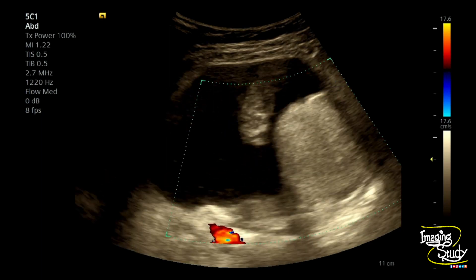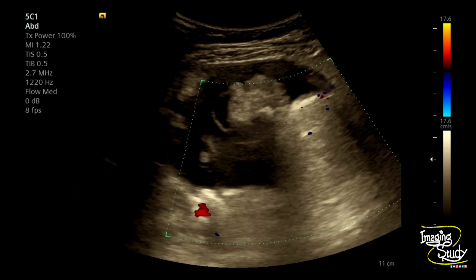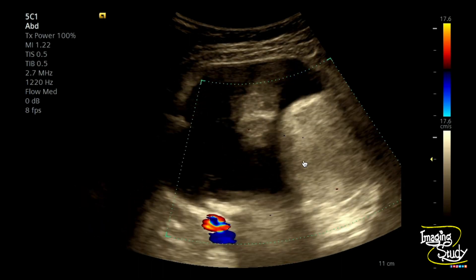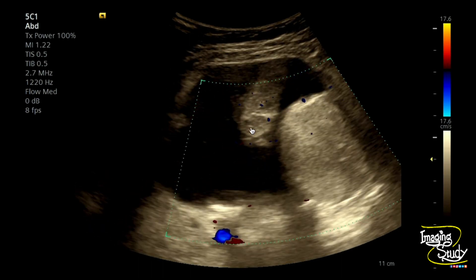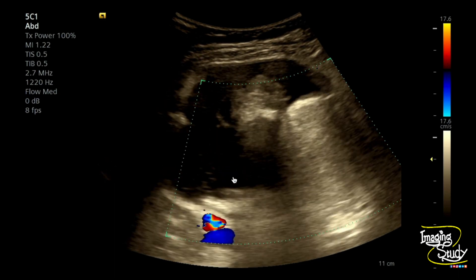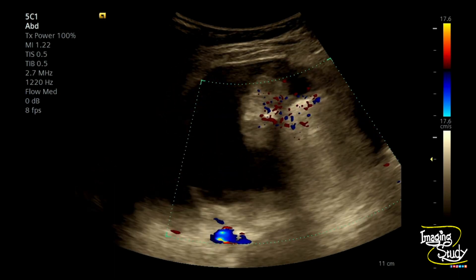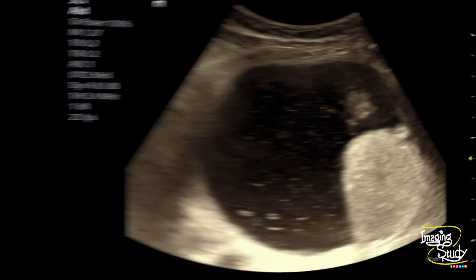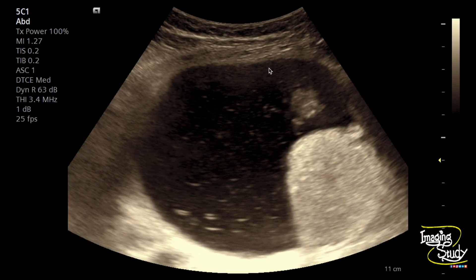Here is another picture with color Doppler — you can see there is no flow within the echogenic intracystic masses. You may get some vascularity within the ovarian stroma, which is quite normal for ovarian tissue. You can see the large cystic lesion with the internal dot-dash pattern of echogenic lines and dots due to hair, and the intracystic echogenic large mass making the floating ball sign.